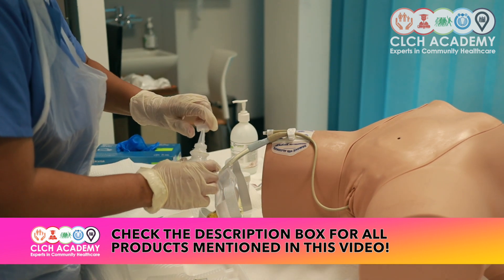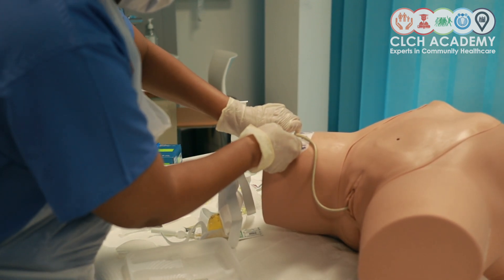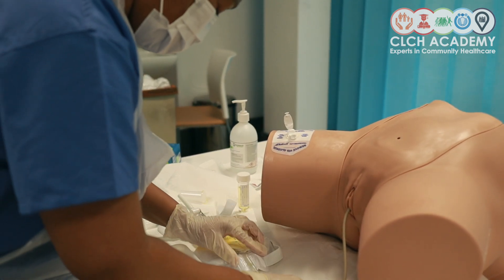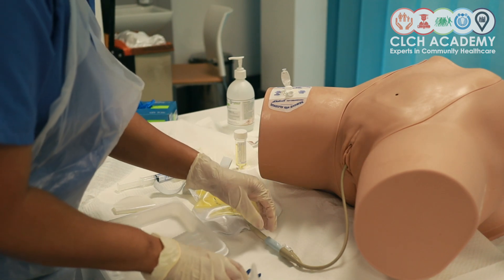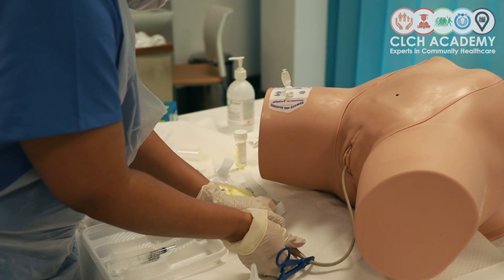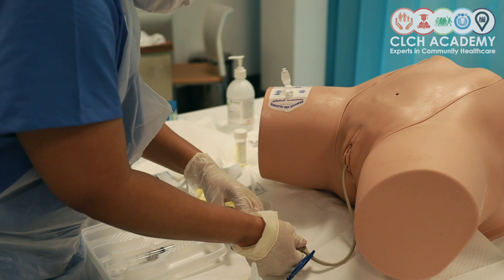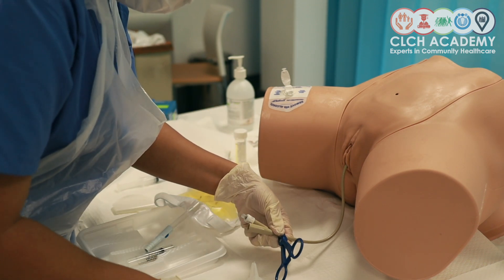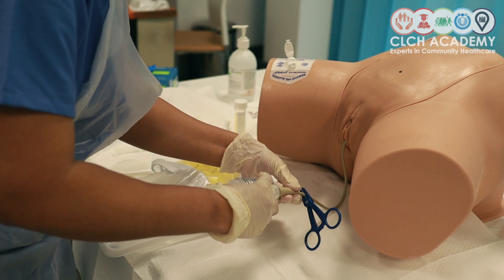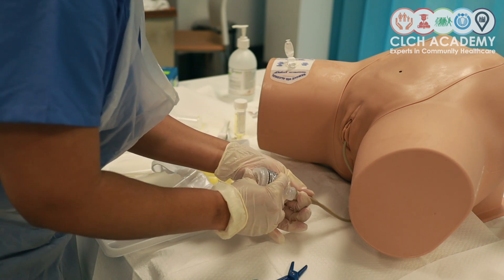So I'm going to remove that, release my secure grip, placing the catheter bag on the floor again, clamping at the top because I don't want it to leak, removing my leg bag, making sure to minimize my contact with key parts, inserting my flush, and just using that pulsatile action gently, then moving my clamp and introducing the contents of the flush.